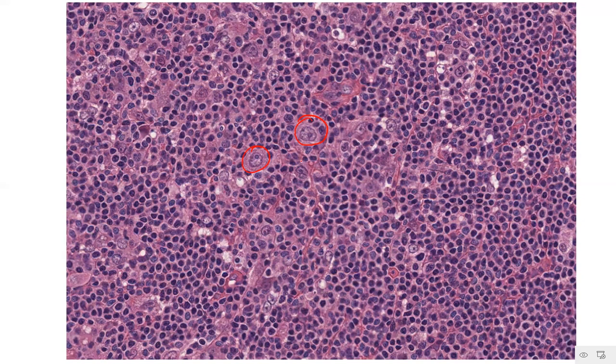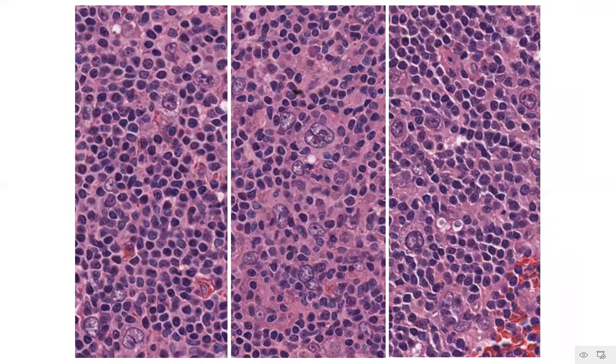This raises suspicion, but again, you will definitely need IHC to finally establish your histological suspicion. Looking elsewhere, within the same case, you come across these cells with prominent nucleolus. As you see, there are these cells which look a little bit like popcorn cells, that is the LP cells, with a kind of a cleaved nuclear contour, vesicular nucleus with pinpoint nucleoli.